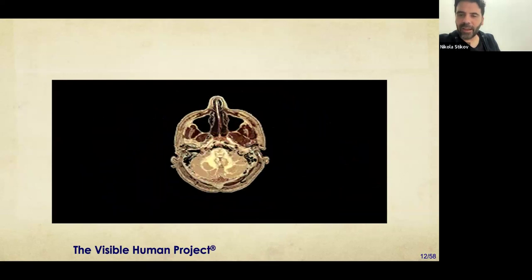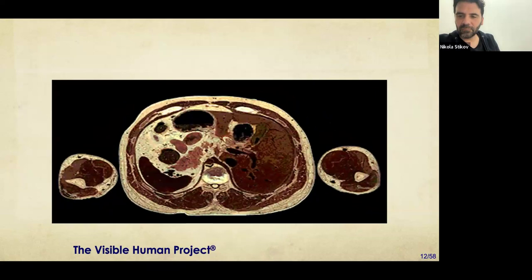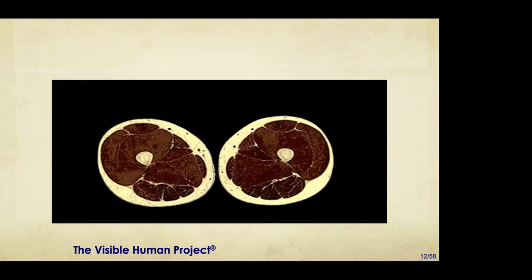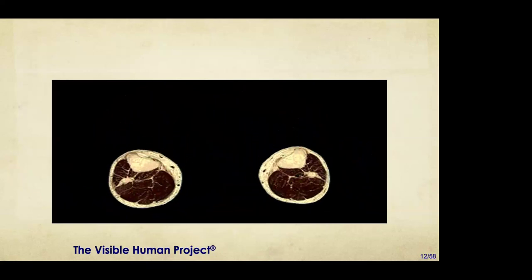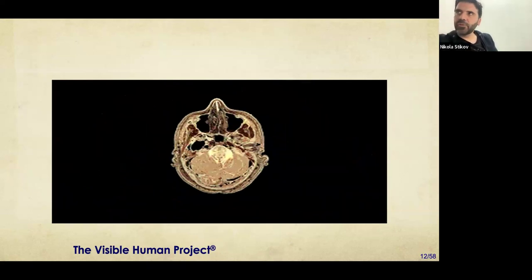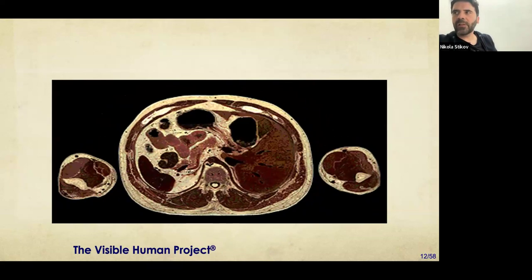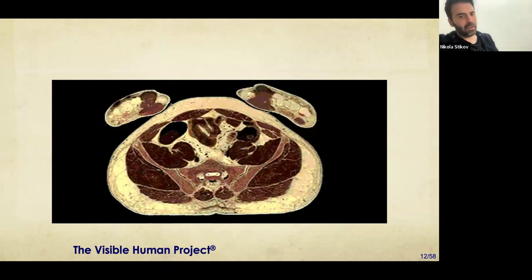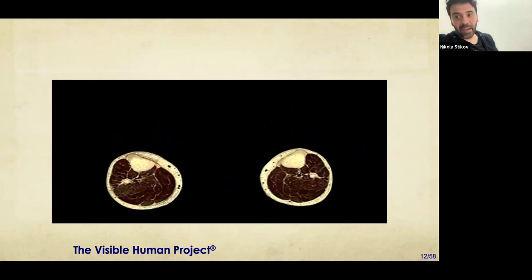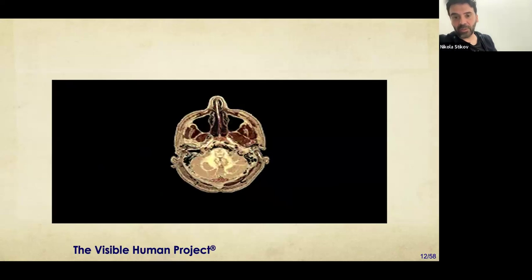How long is an MRI scan? Do you know? When I have had some exams, it was like 15, 20 minutes that I had to stay, usually. So it depends on the resolution you want to get. It depends on what you're actually looking at, but you could get a very nice anatomical image in about 10 to 15 minutes. And then depending on the protocols, people sometimes add other things. Scans can go up to an hour, but usually 15 minutes is optimal to get a good image.